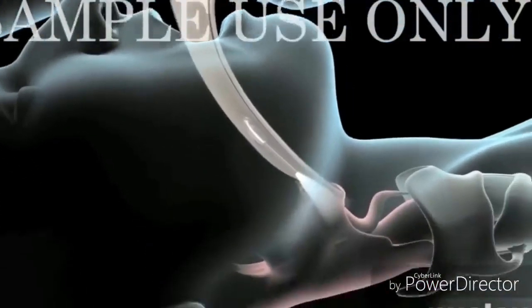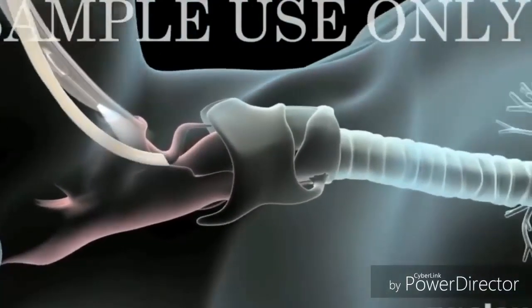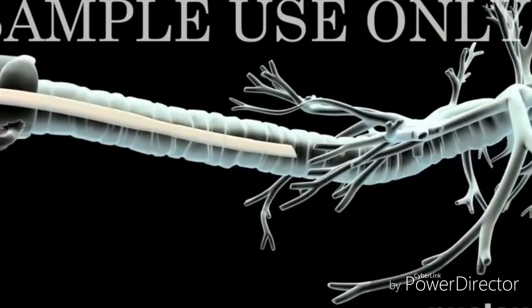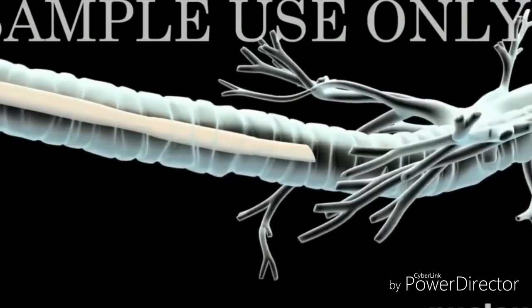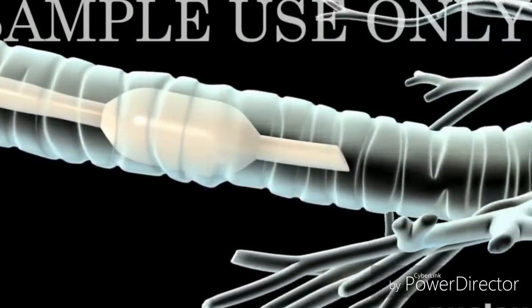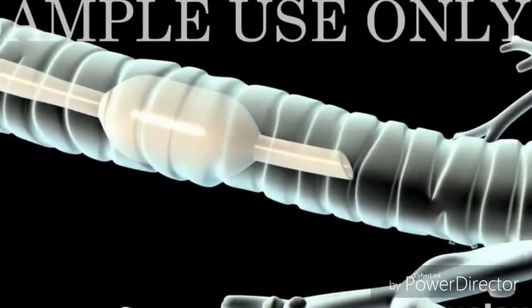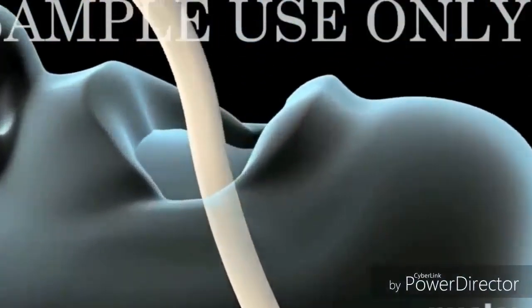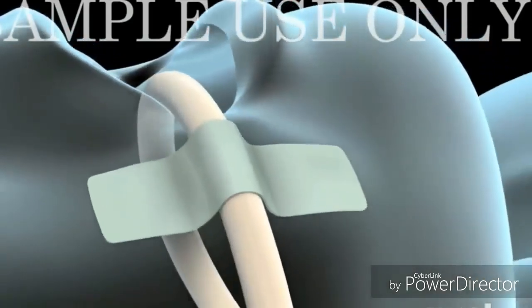Here we are going to introduce the endotracheal tube. The endotracheal tube should be introduced into the trachea. After the introduction of the endotracheal tube inside the trachea, you are supposed to inflate the bulb which is present distally at the end of the endotracheal tube. Now gradually remove the laryngoscope. After removal of the laryngoscope, the endotracheal tube is fixed at the corner of the mouth.